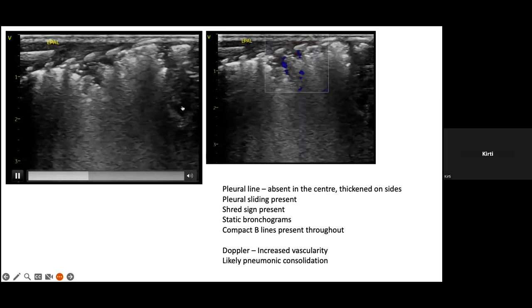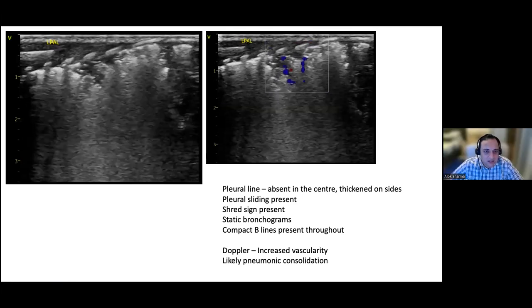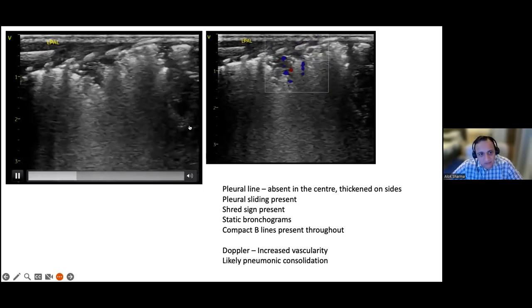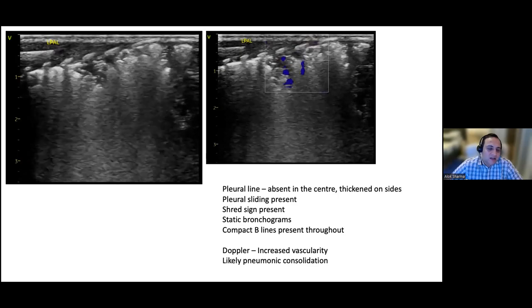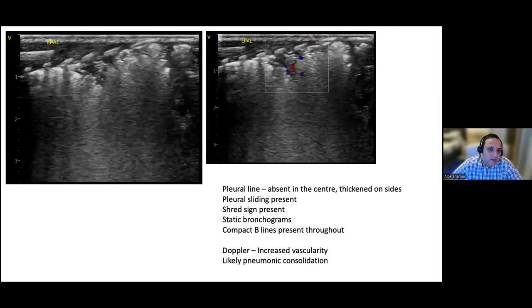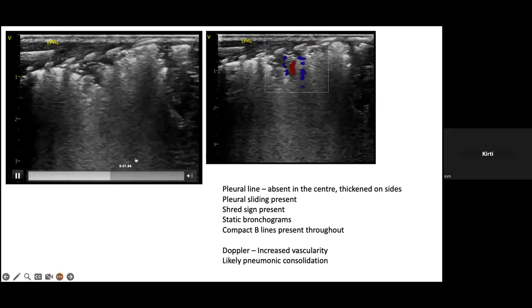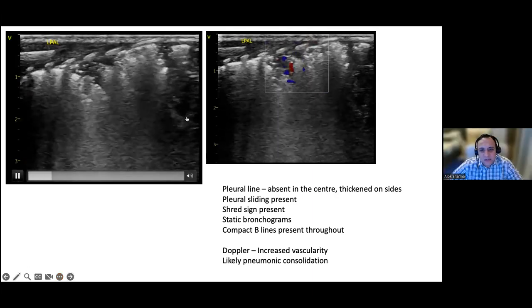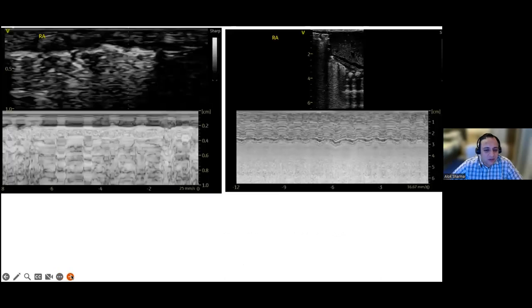Further down. Can you see how irregular that margin is? So is this just a large area, or within the lower lobe, which is irregular, which basically looks like lung that might be a little bit moth eaten? Okay. So putting Doppler there would also help, just to see whether it has vessels. But yeah, this poor kid, it's got an infective kind of pneumonic presentation.